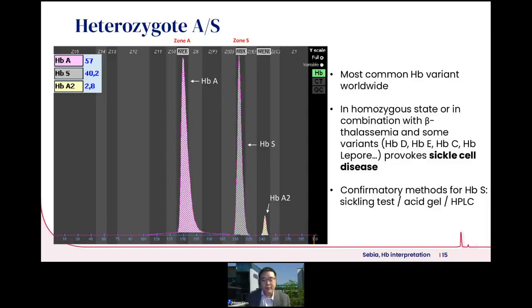So let's look at examples of the common variants. This is the heterozygous sickle cell trait. You see in the capillary electrophoretic profile, it's very defined within zone S. Once again, the percentage of hemoglobin S is slightly less than that of hemoglobin A. It's also the most common hemoglobin variant worldwide.